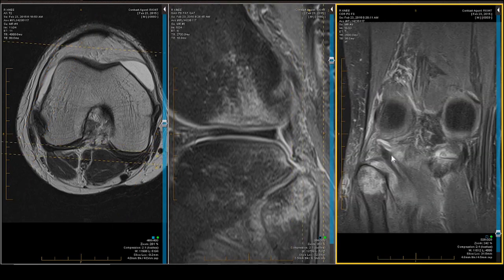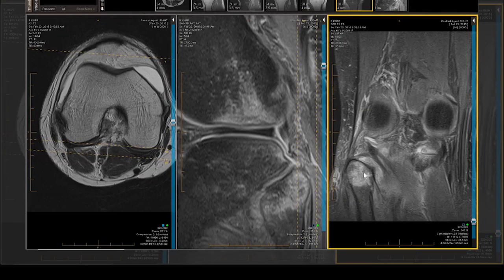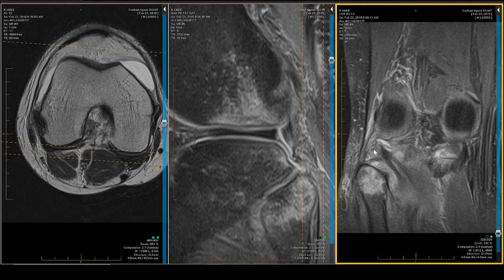Let's see if we can identify any of the arcuate in the coronal projection. Here is a blunted vertical limb — the lateral limb of the arcuate — and then there should be an oblique limb that comes right from here and courses over this way. Now look at that course: it's filled in with blood. So we have an arcuate tear.